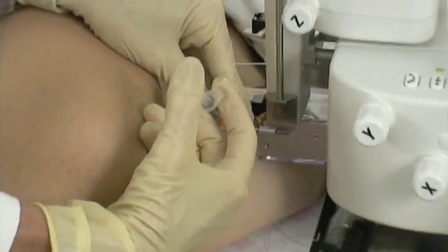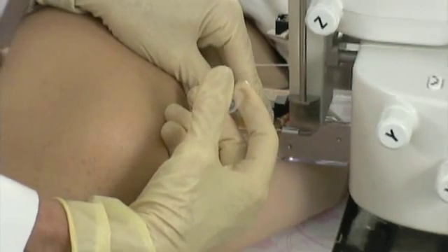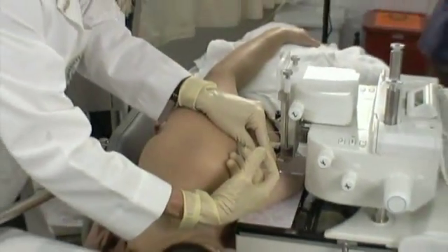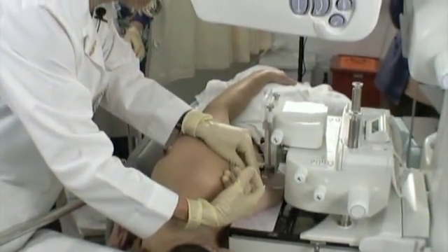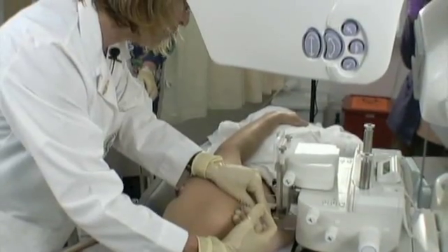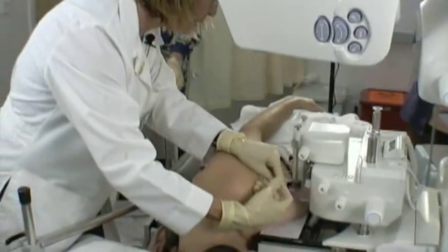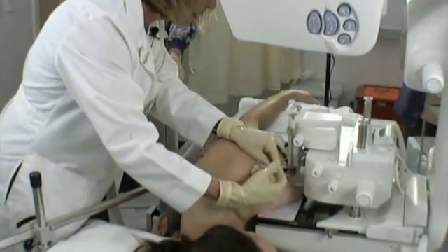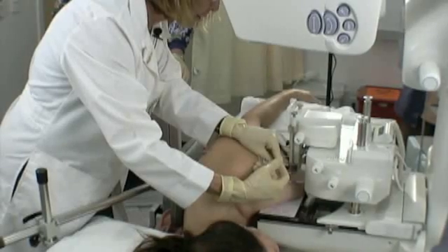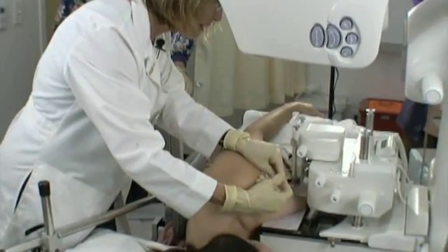A little stick coming right there — a little burning and stinging is normal. I bring up a good skin wheal so that I have plenty of room to work. I use one percent buffered lidocaine, buffered with sodium bicarbonate at about a ten-to-one dilution. I find that really does help take the sting out of the injection.